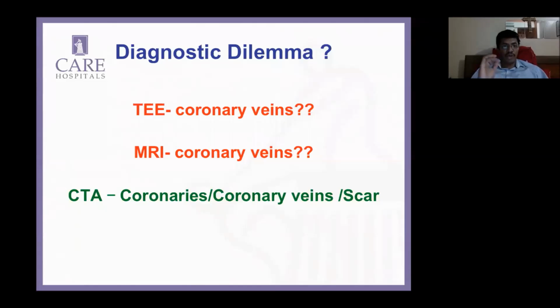specifically looking for delayed enhancement in the posterolateral wall, which would be a real bummer in terms of being a responder or not. So if you have a near transmural scar in the posterolateral wall adjacent to the posterolateral vein, which would be the ideal location for putting in the lead, then that lead is not going to pace. Now, many people, and there are reports of using multipolar leads, but you just leave that controversy aside, and we have found that many of these patients turn out to be non-responders.